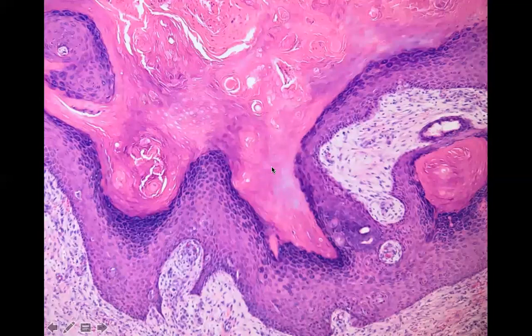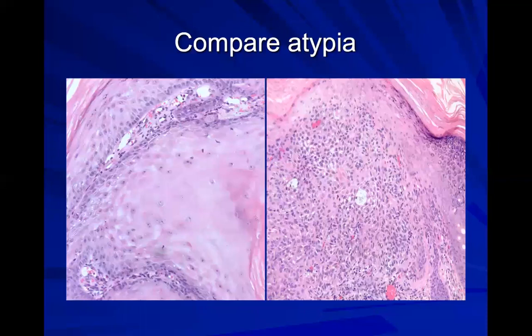These lesions are just called straight up KAs, whereas the stages before, some might call it a squame KA type, or a KA can't rule out squame, because there's a lot of overlap. So compare the atypia. This is reactive, glassy pink, could be just KA, and this is true atypia, where you have these atypical nuclei.